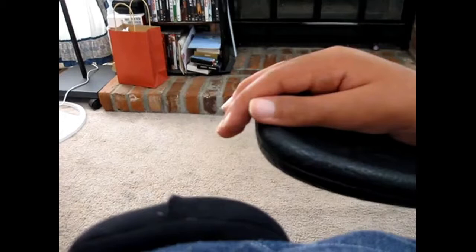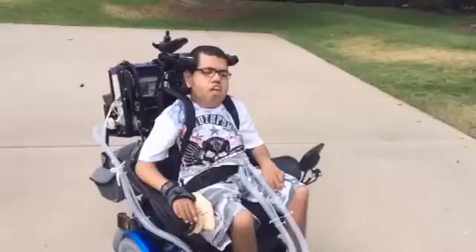The only reason for that is his wrist has started to deviate to the side. We need to keep his wrist straight to keep his finger in alignment with his fiber optic switch so that he can consistently reach it. He's using a very, very small movement. So let's watch this video of Julian.